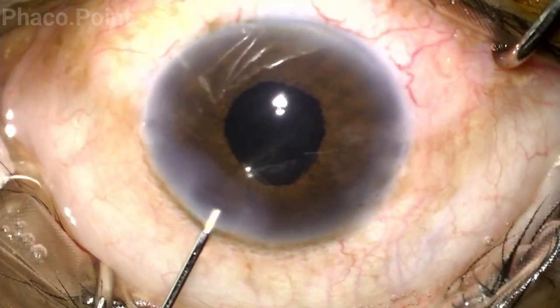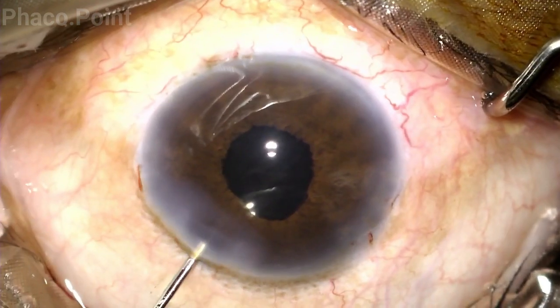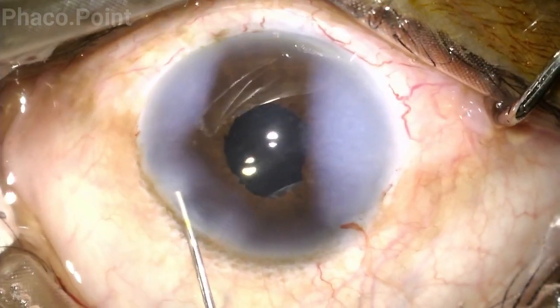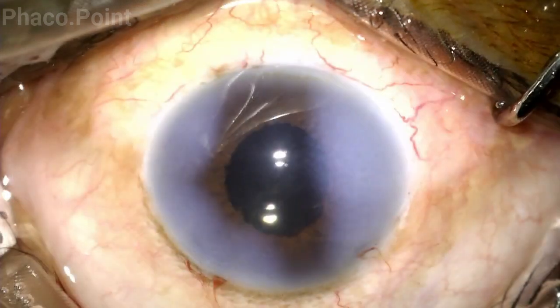At the end of irrigation aspiration, we injected a little pilocarpine, washed it out again, and completed the case by performing a stromal hydration. This was the end result at the end of surgery — tiny tears visible in the pupillary edge, and a pupil that at the end of surgery came down to about three to four millimeters.